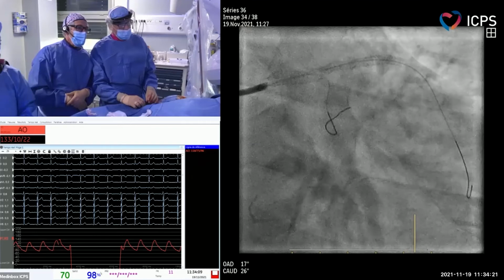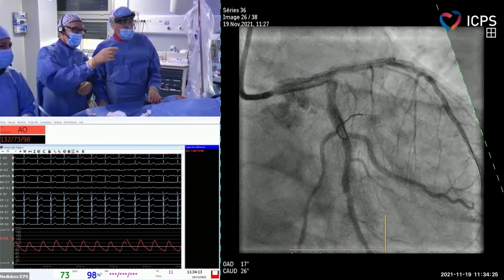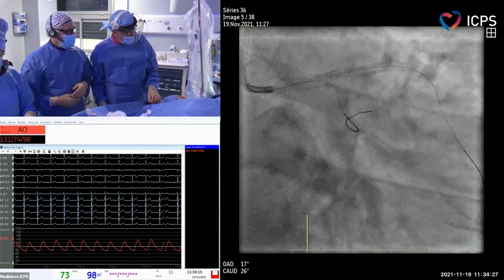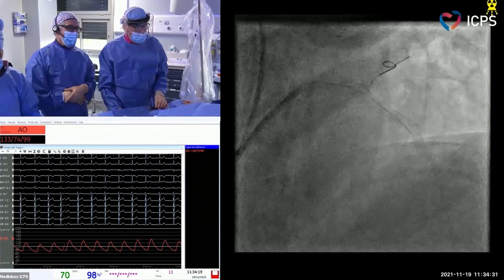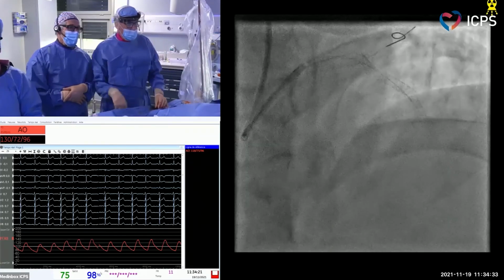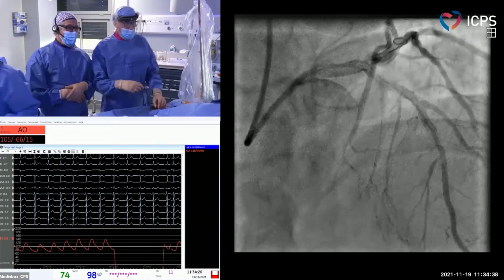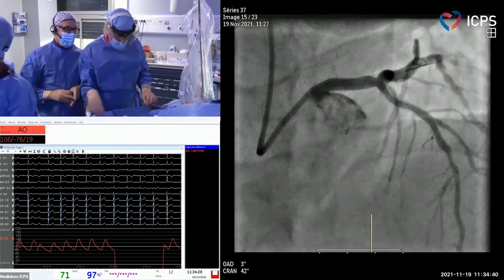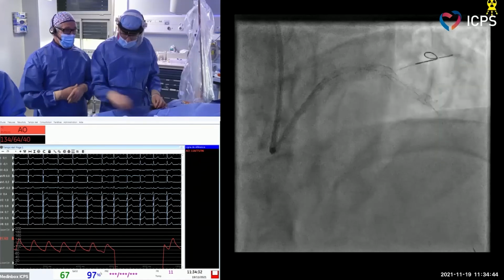So as it was said by Thomas, we don't see really well the ostium of the circ in any view. We tried many views before being live. In fact, there is no good view. Okay, so now we have a nice size of the left main. We have good result in the LAD, and we'll do the OFDI.